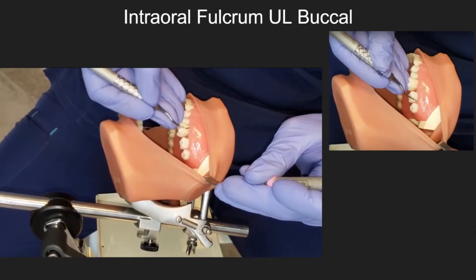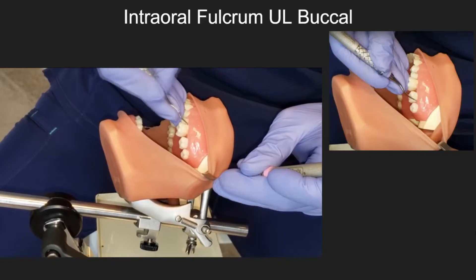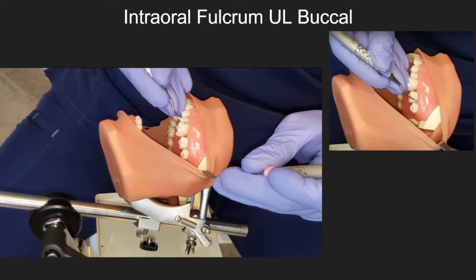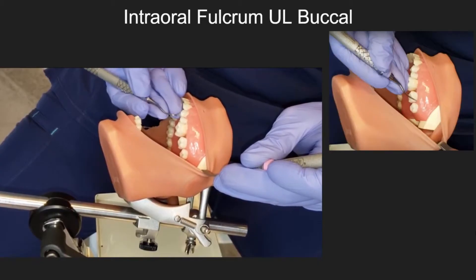Intraoral fulcrum — upper left buccal. Notice how the clinician is maintaining a modified pen grasp with a palm up position for the maxillary arch while rocking on the fulcrum.